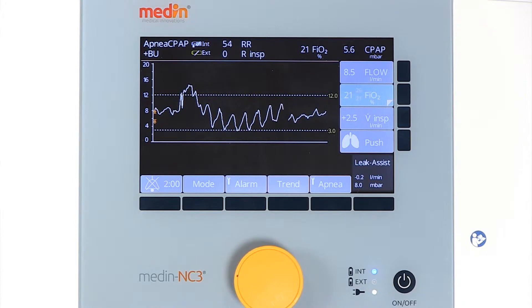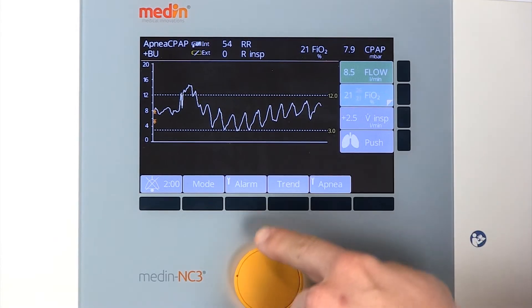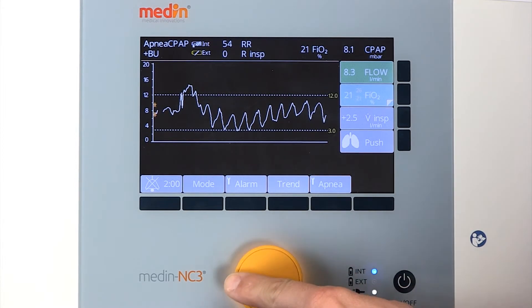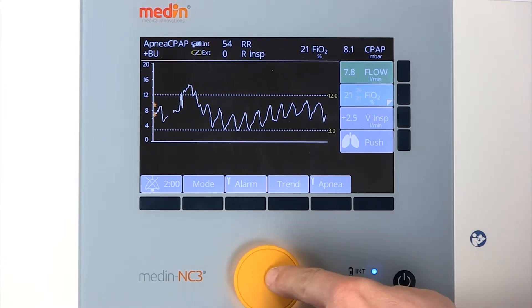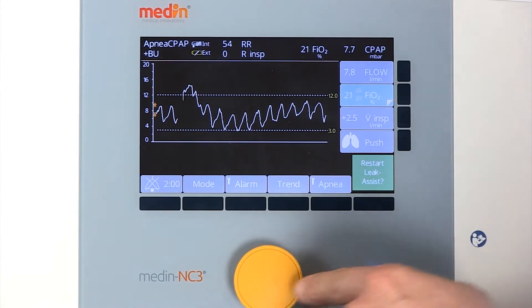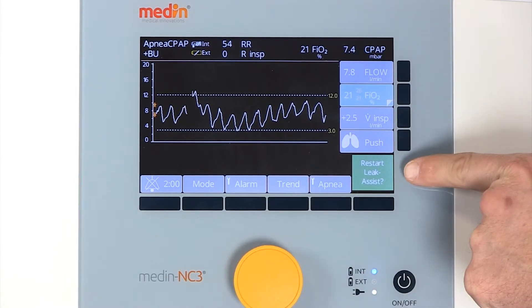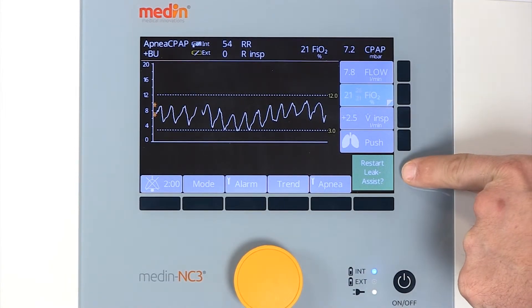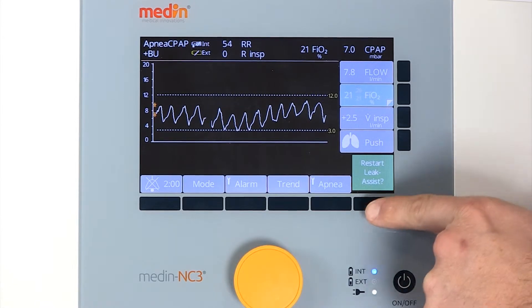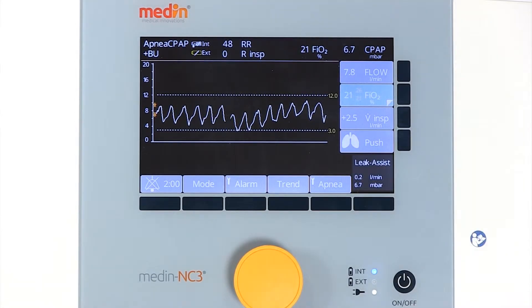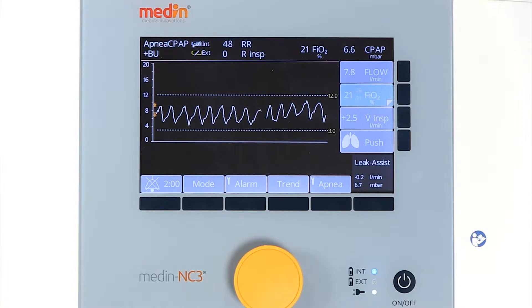If the CPAP pressure is changed, the leak assist function stops and an information window will prompt you to restart it. A tight fitting CPAP system and efficient application guarantee a constant CPAP pressure and effective leak compensation.